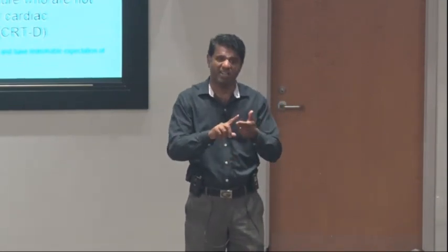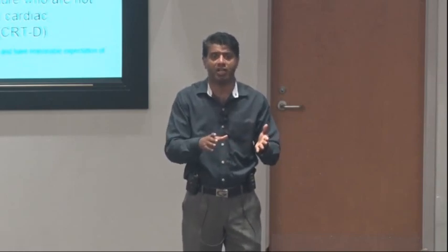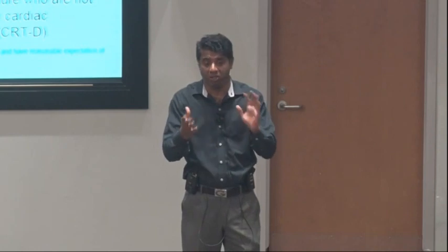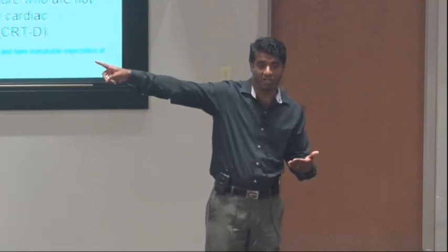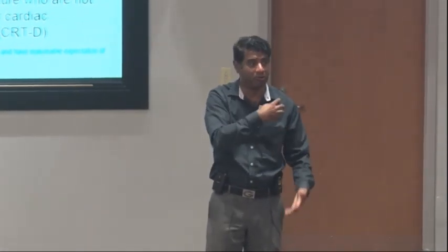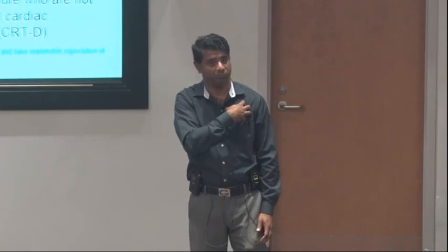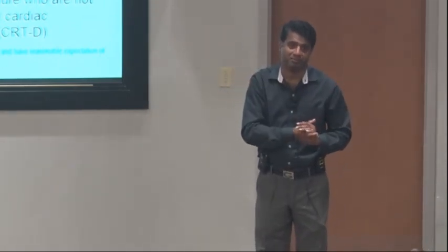So you can catch AFib. I've caught so many things. You can catch AFib, heart failure, all those things. They're very good. Now these days they have wireless programmers. So I can actually have an iPad in my office, the device check guys check it, and it will screen to my iPad. You can actually program the device from here without ever putting a wand on them. They're very, very good. Home monitoring has revolutionized device checks.